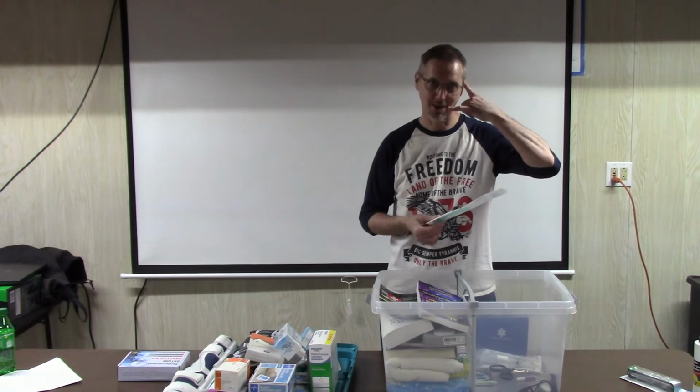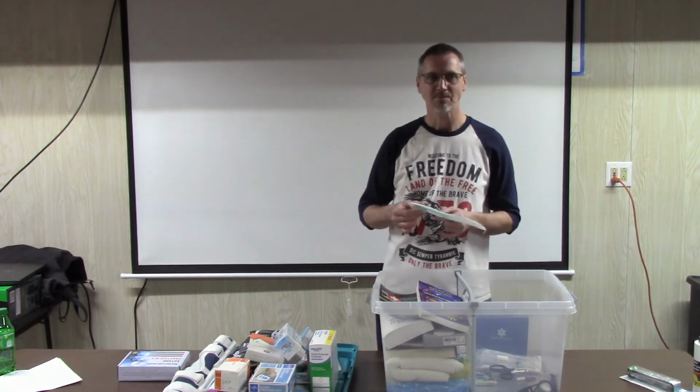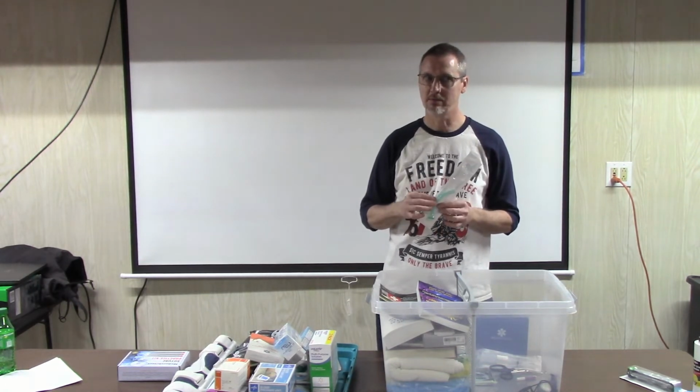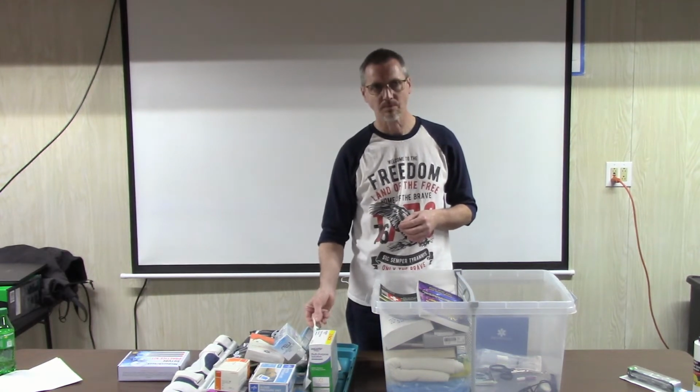I'm getting one of these. So, from your nose to your ear canal. You measure from your nose to your ear canal, and that's your average size for your nasopharyngeal. How about diameter? Do you know that? Diameters are normally pretty standard. Okay. You should also get lubricant with those.